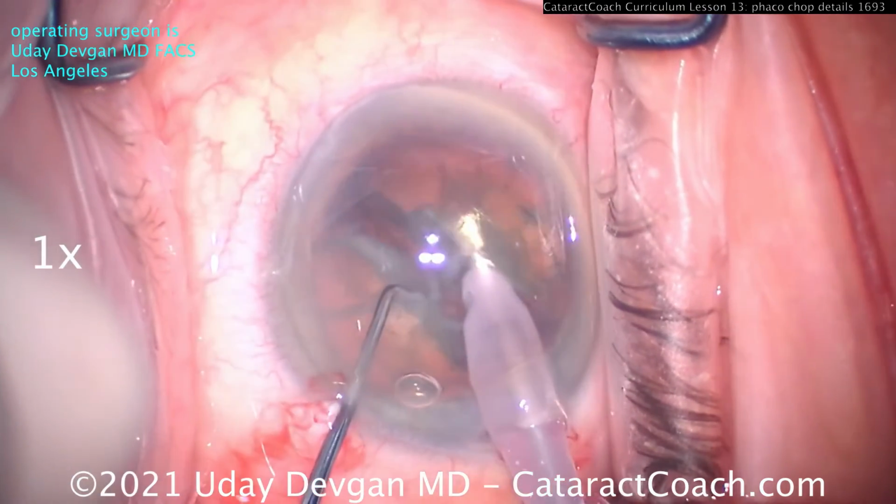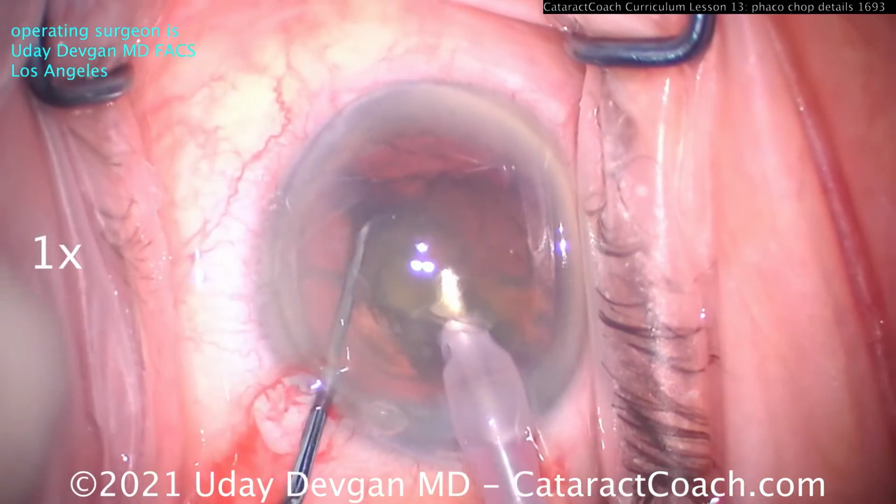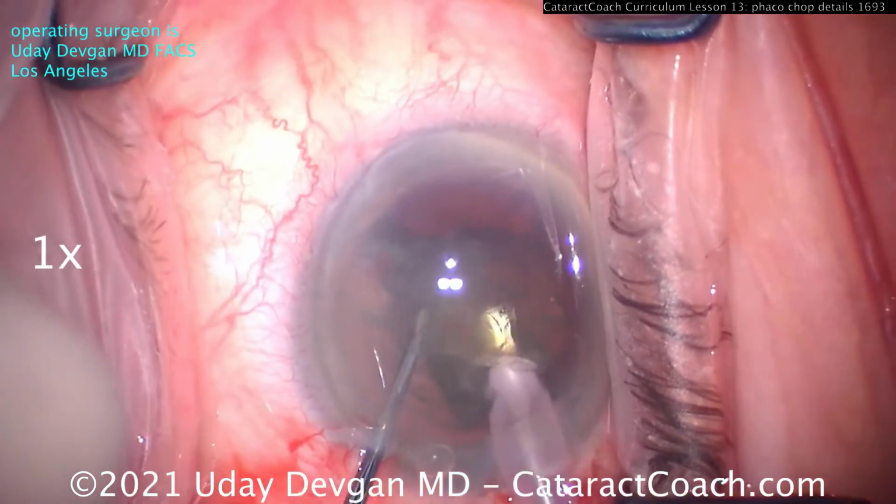Apart. There are the two halves. Hold one nucleus at bay. The other half is brought up, and that looks great.